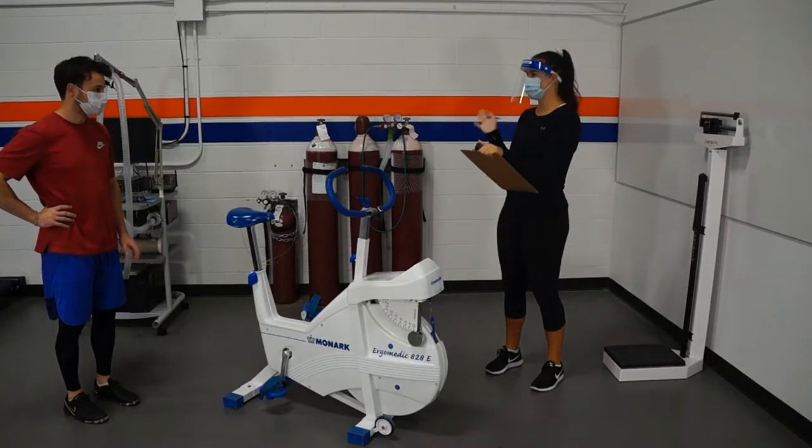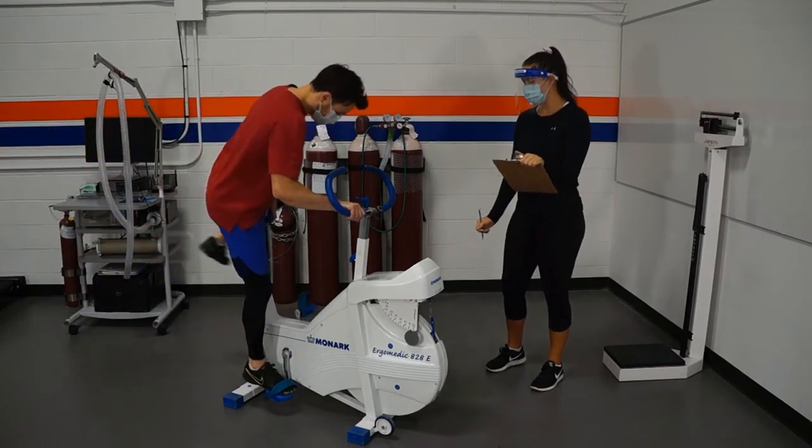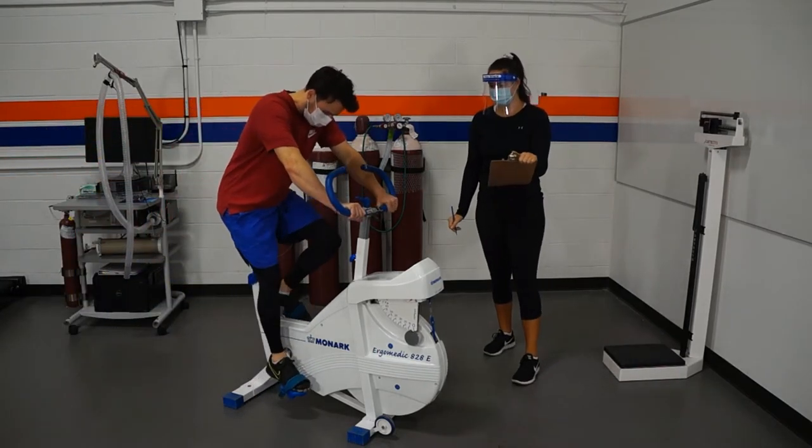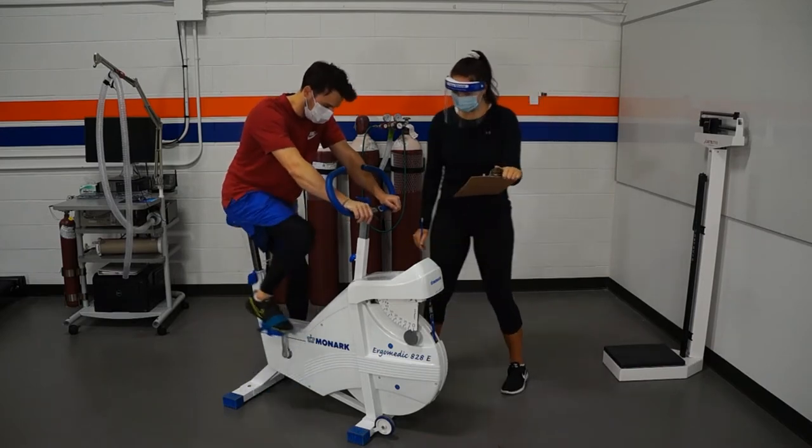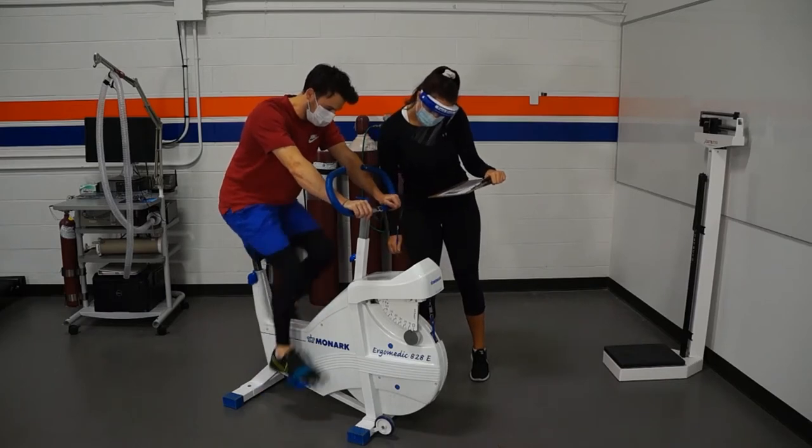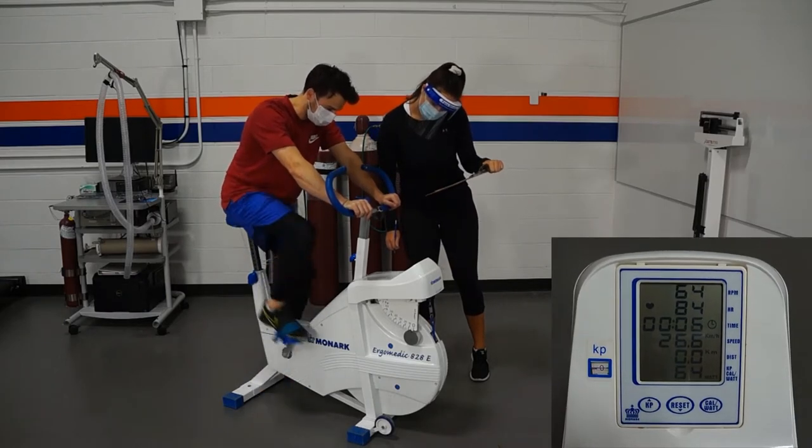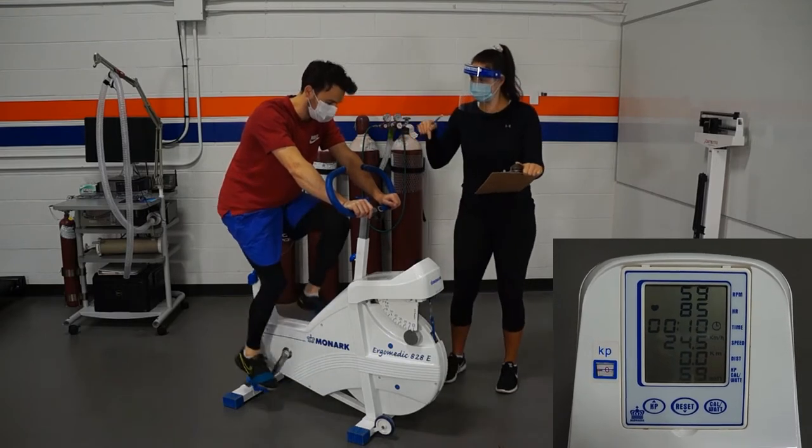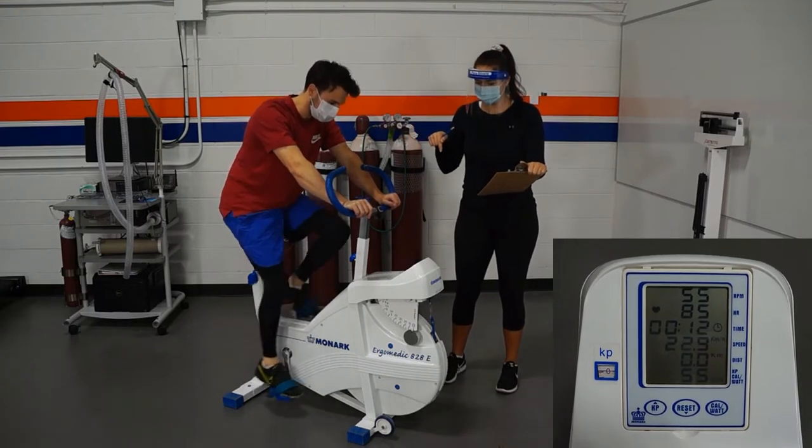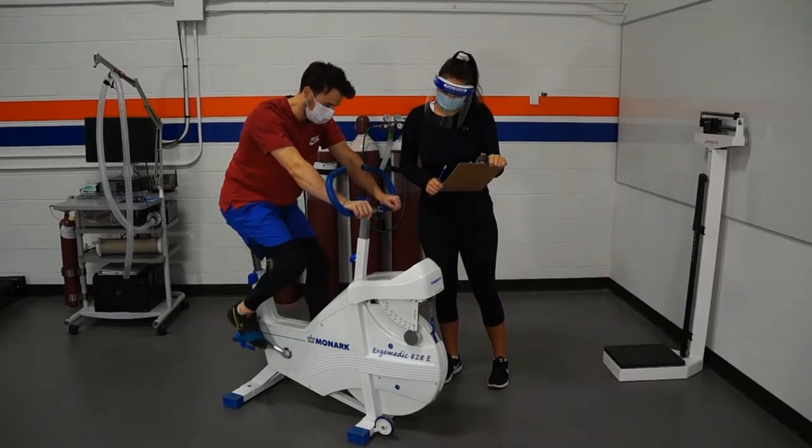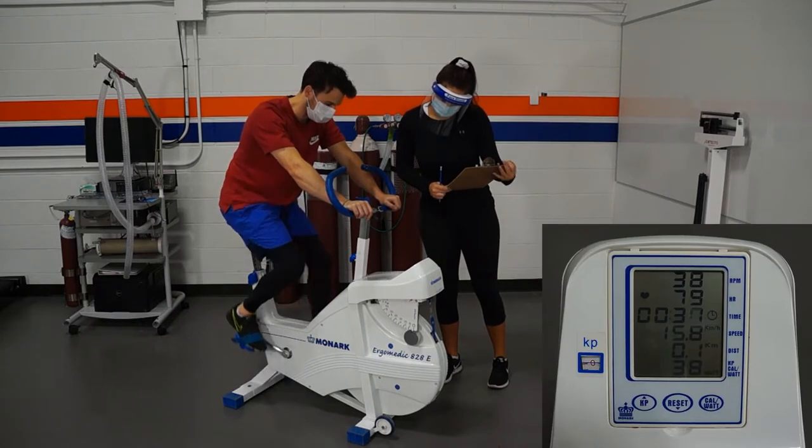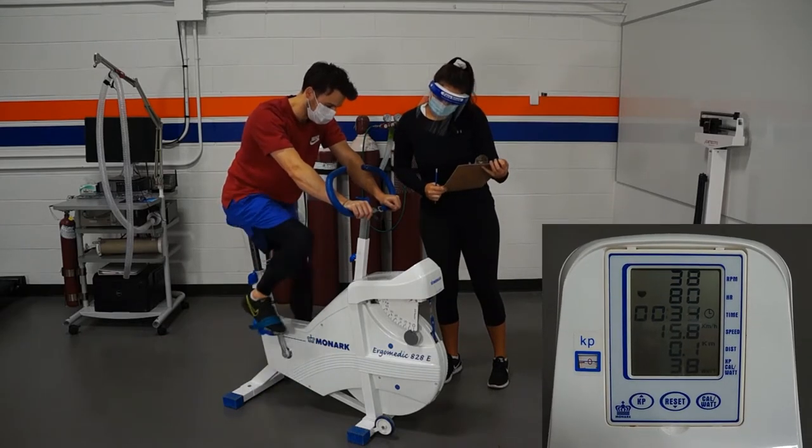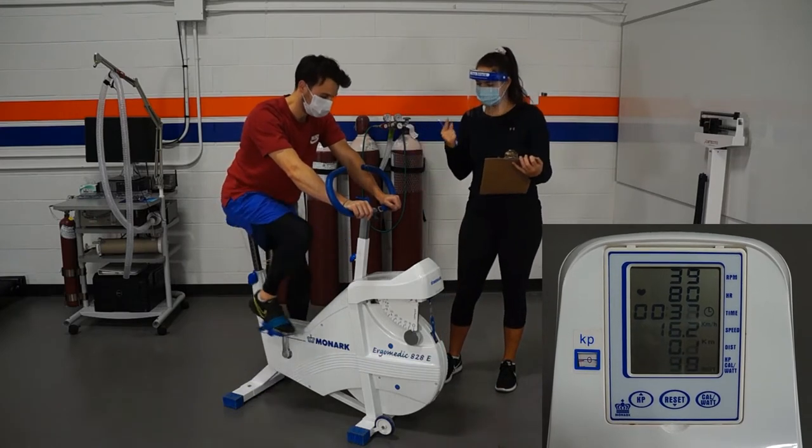In order to begin the test, have the participant properly situated on the bike and begin pedaling. Once they start pedaling, take note of their RPM using the display. You can see that it's the top row here. If they're pedaling too fast, instruct them to slow down until they can maintain a steady cadence of 50 rpm. They should be able to maintain this RPM with zero resistance on the bike, but if they pedal too slow, you have to instruct them to pick their speed up.